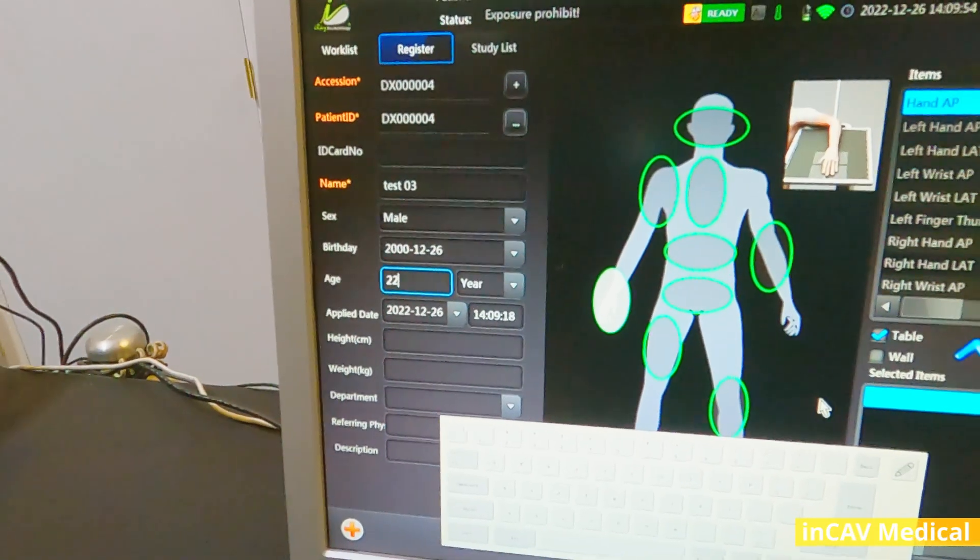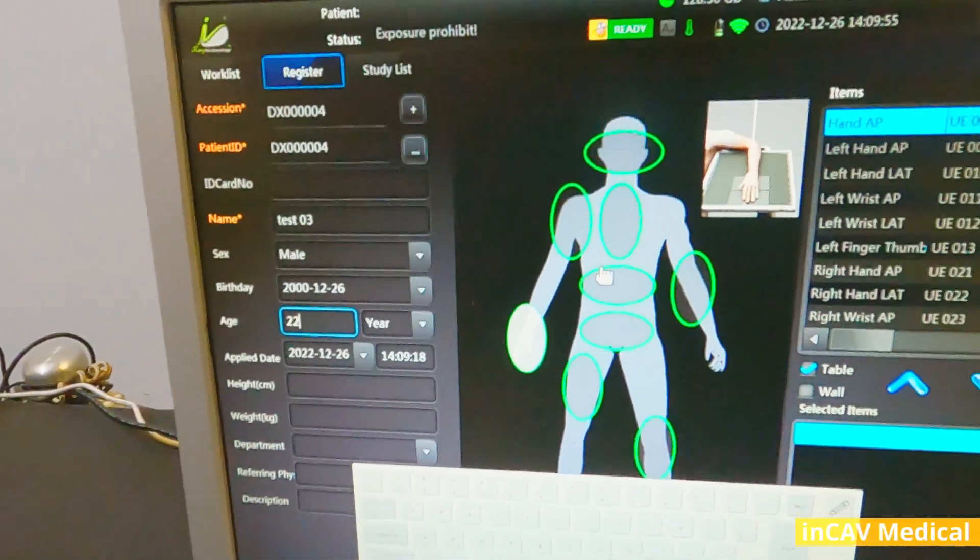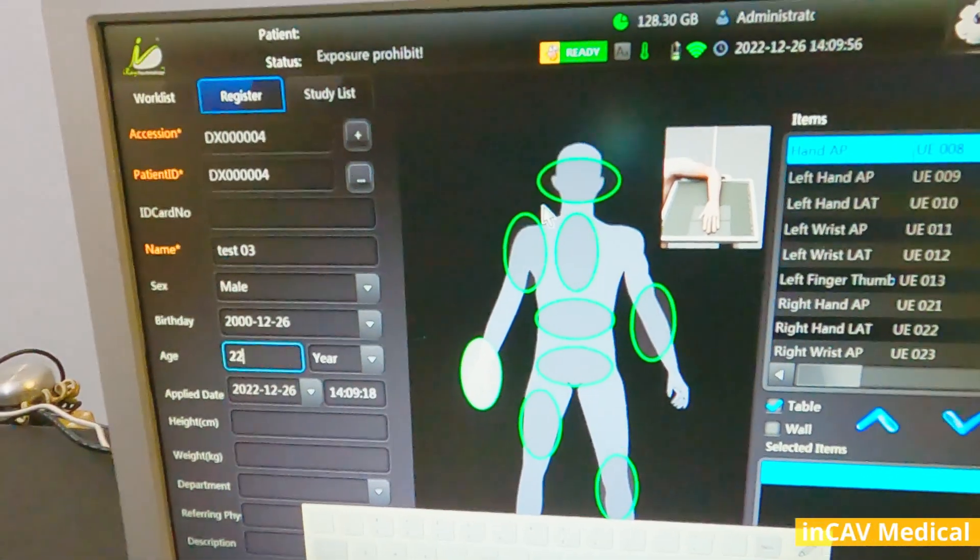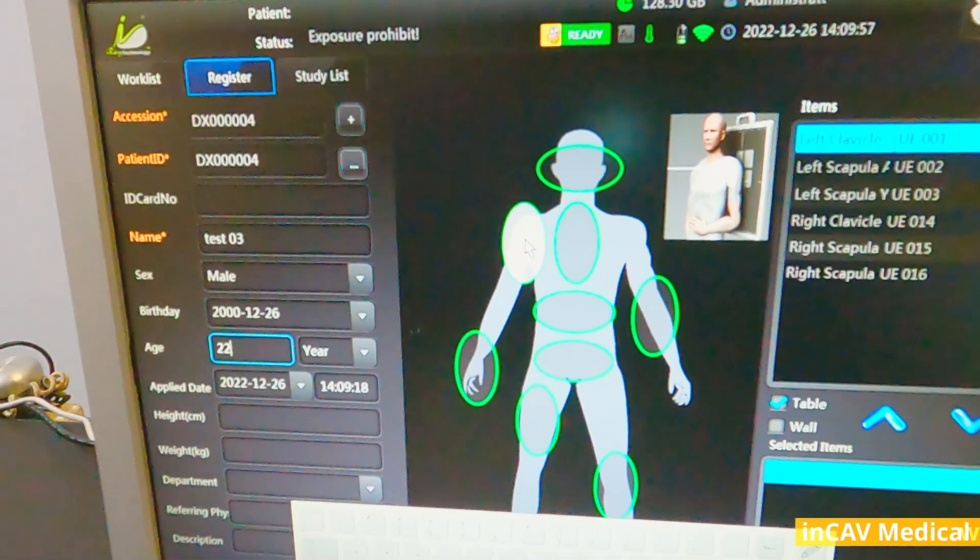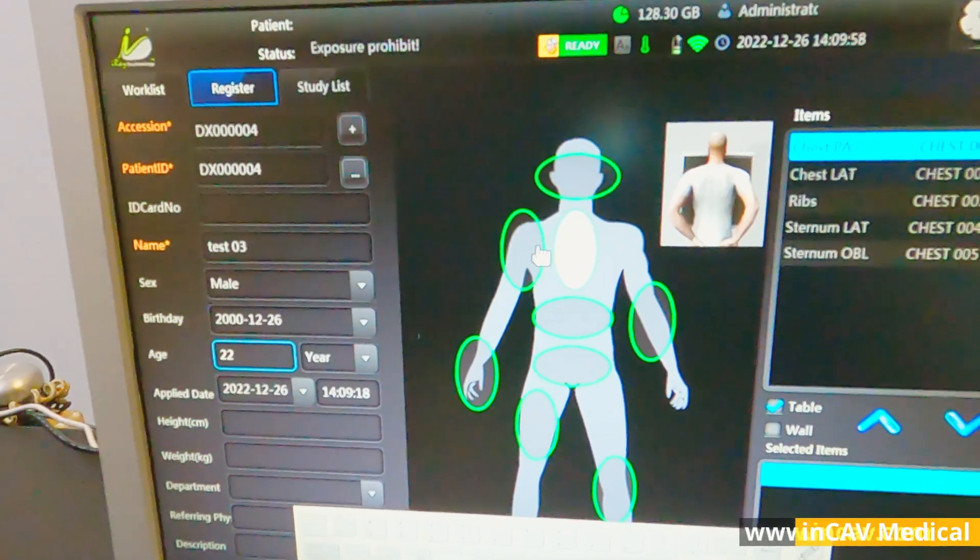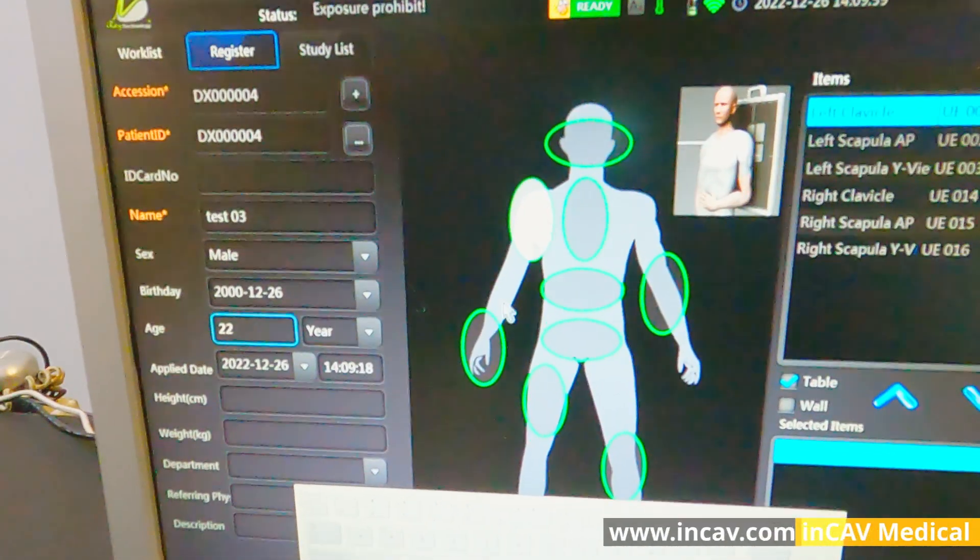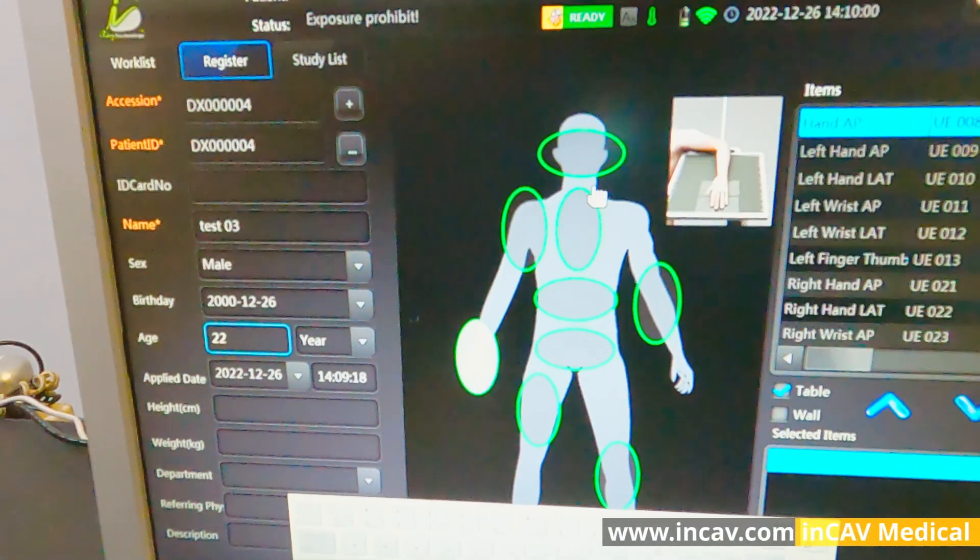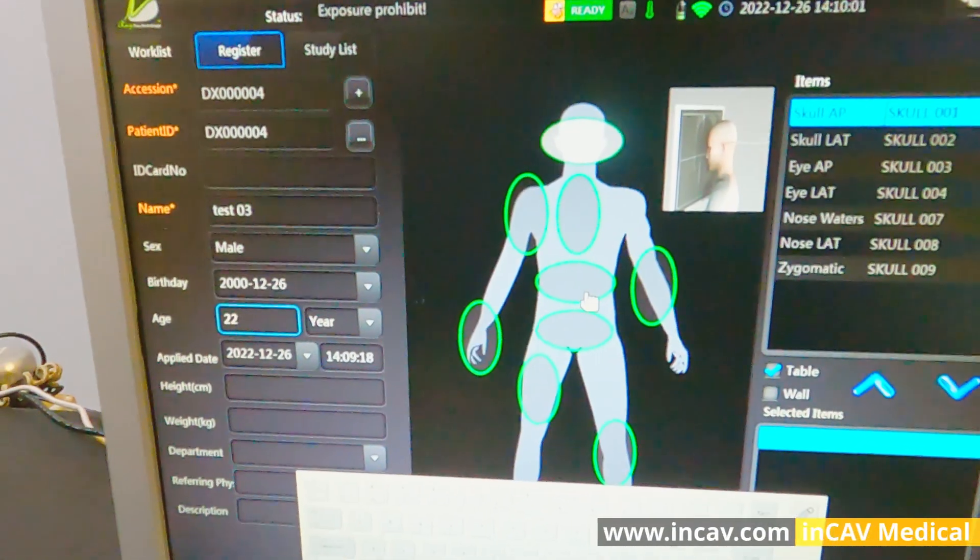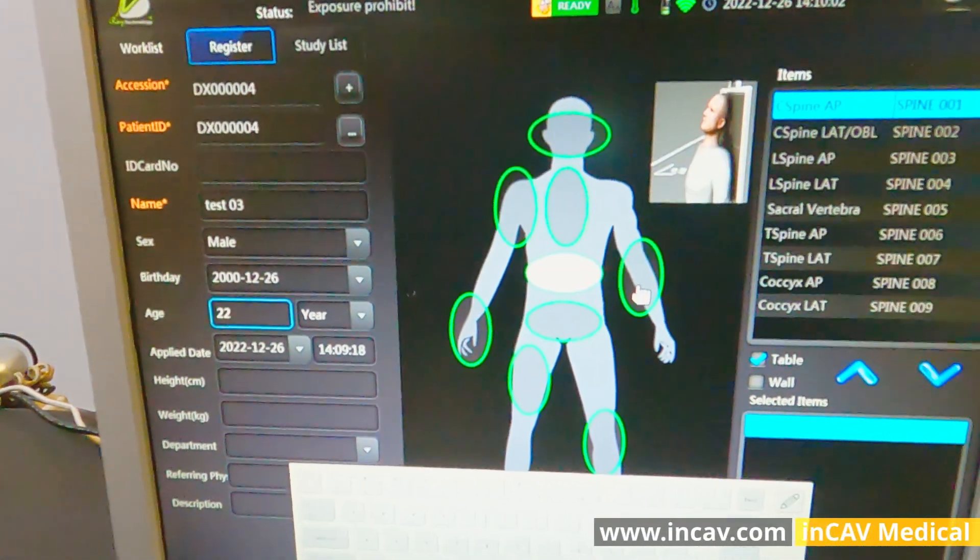Now we click on the green area to choose what kind of study we are going to do. As you can see it is very intuitive and easy to use.